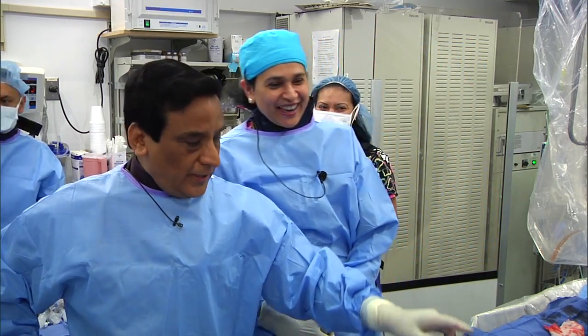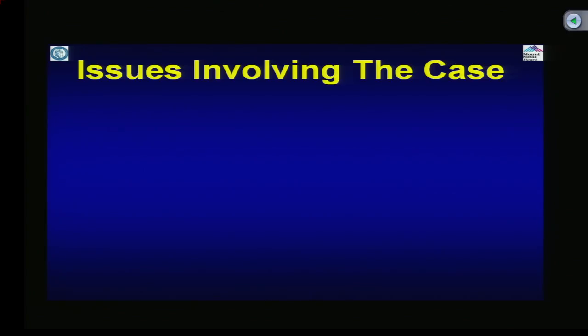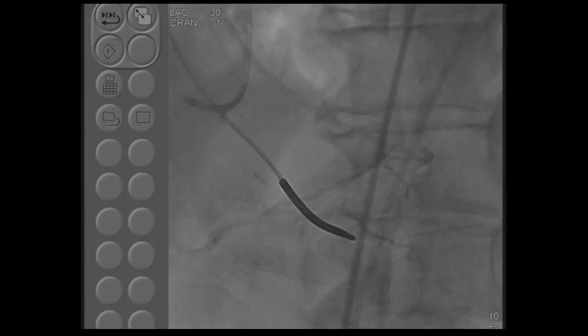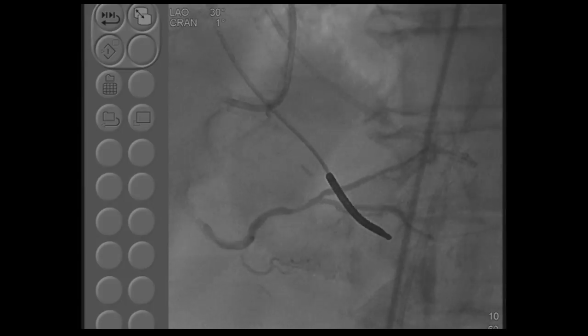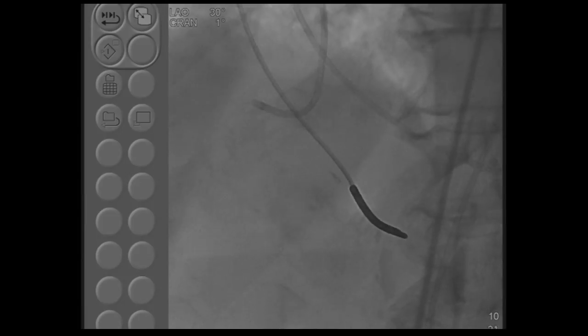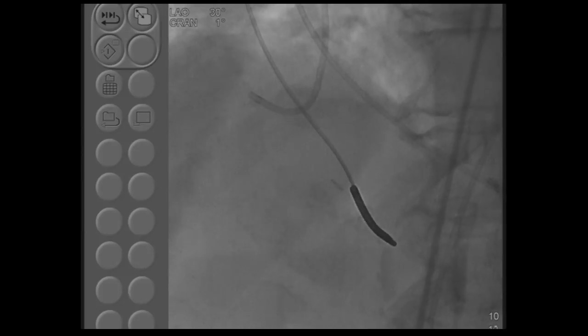Good. Now with that note, while we are getting ready, this is the Shepherd Crook right catheter of Medtronic. SCR, you know, anytime you have the upward takeoff of the right coronary, you can use the AL 0.75, but we found the Shepherd Crook SCR. It's available in 3.5, 4 and 4.5 based on the upward takeoff and gives you very good support. So this is what we are using now.